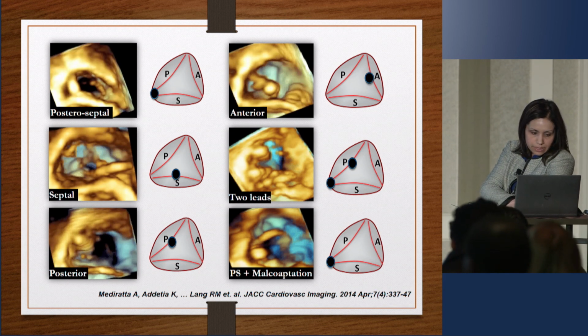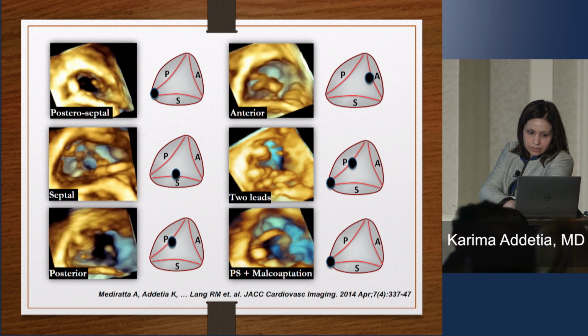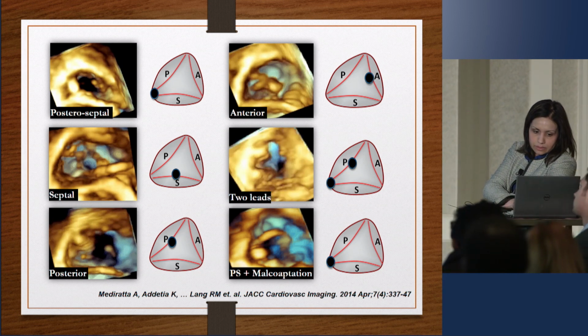Let's see if we can get that to play. So I don't know why these don't want to play. But this one here was an example of adherence of the pacemaker lead to the anterior leaflet. And okay, this one is playing.